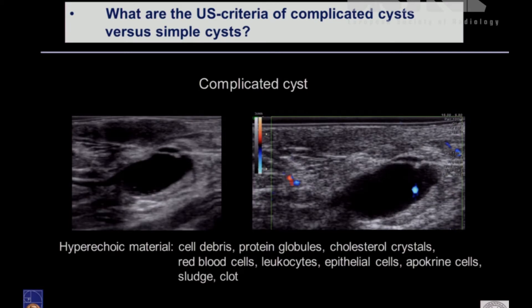Another example: you see some echogenicities inside the cyst — it can be debris, sometimes calcium. If you activate the color Doppler, you can see some color popping up and moving through the anechoic fluid. This is typical for sedimentation from inside cell debris, globules, and crystals inside the fluid.